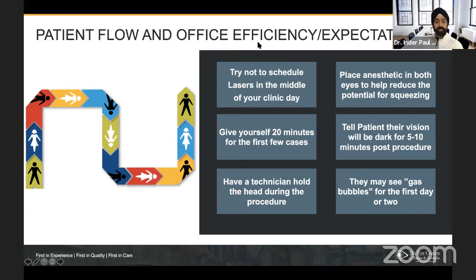I mean, we're talking about a handful, but I have had a couple where I've gone up to about 40, 50, and 60 even in some cases, but they're all the same type of patient, not for a Weiss ring. Out of the thousands and thousands I've done, I've never had a pressure spike from a Weiss ring. It's always been the patient who had amorphous, larger diffuse clouds that are behind the lens, especially a pseudophakic patient.